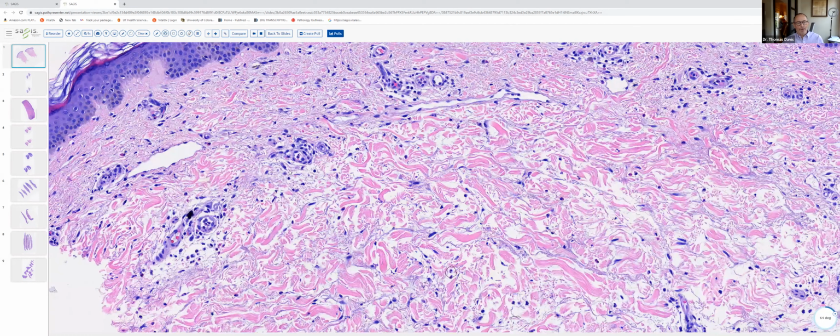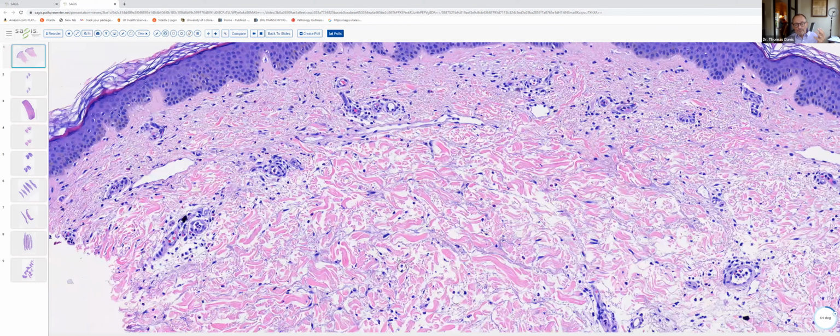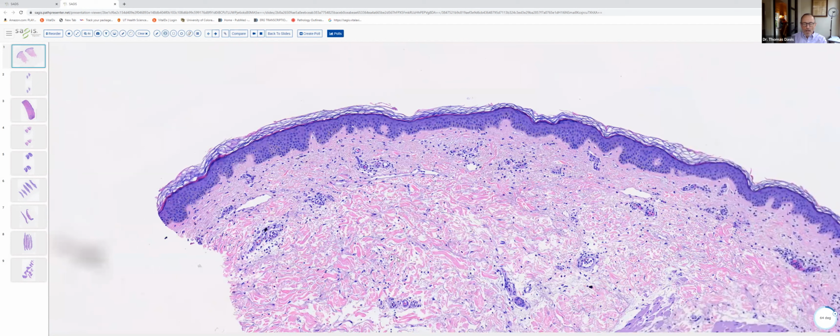Acute urticaria doesn't get biopsied very often. In acute urticaria, one usually sees just the sparsest of perivascular lymphocytic infiltrates. And frequently what one will see in acute urticaria is neutrophils within vessel walls. You can see a little bit of that here. Sometimes there's a tendency of the neutrophils to line up along the periphery of the postcapillary venules, margination, so to speak. And then ultimately, as the urticaria becomes more chronic, the neutrophils and eosinophils work their way out into the dermis.